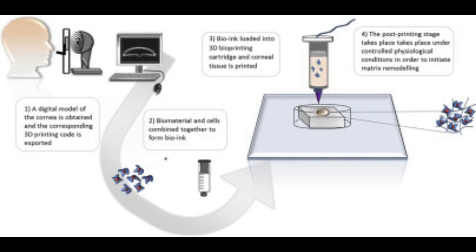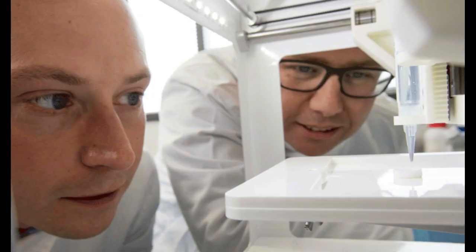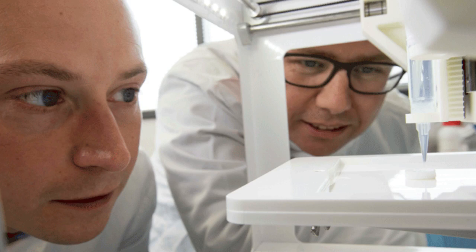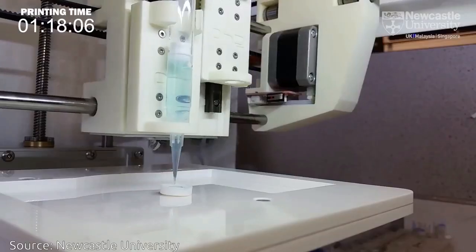The proof-of-concept research reports how stem cells from a healthy donor cornea were mixed together with alginate and collagen to create a solution that could be printed, a bio-ink. The combination of alginate and collagen keeps the stem cells alive while producing a material which is stiff enough to hold its shape but soft enough to be squeezed out the nozzle of a 3D printer.